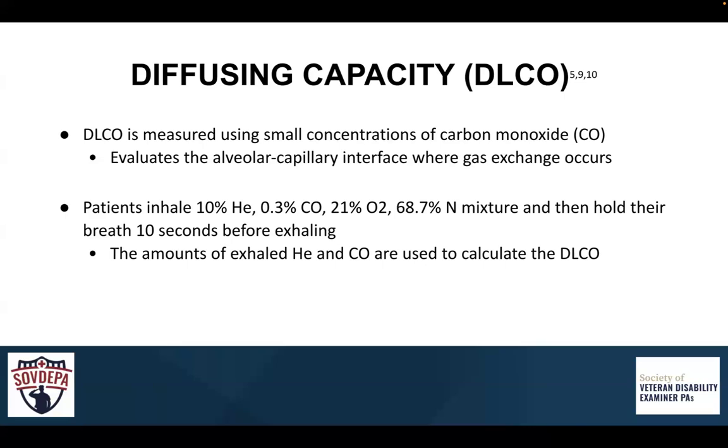Carbon monoxide is used to estimate gas transfer instead of oxygen because carbon monoxide has a much higher affinity for hemoglobin. DLCO test results are adjusted for the hemoglobin level, and they are also corrected for altitude because as the altitude increases above sea level, DLCO increases unless corrections are made, because DLCO varies inversely with changes in alveolar oxygen pressure. This is not something that we typically do in our office. This is a send out test.